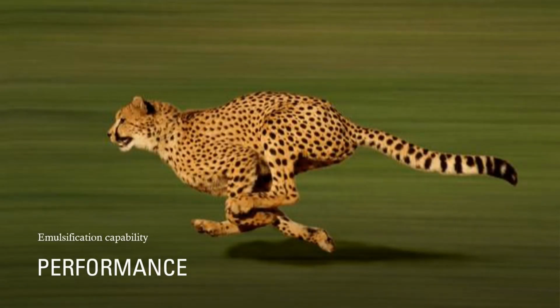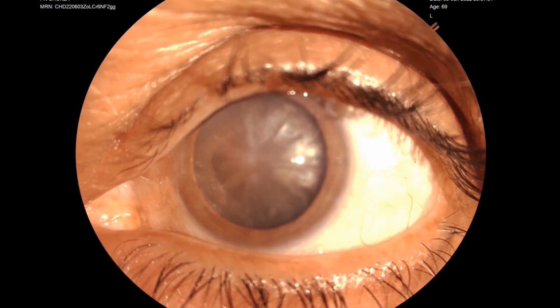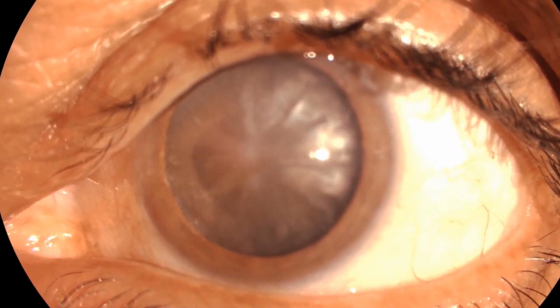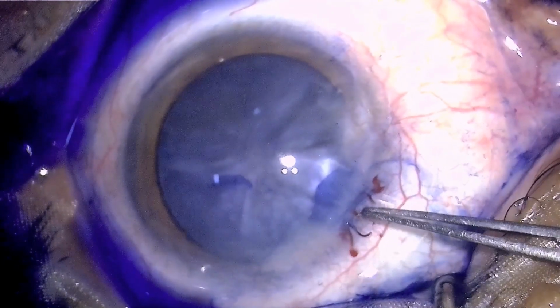Coming to the performance, I'll just demonstrate one case which was done for removing a hard cataract. This is the kind of cataract we are talking about. The machine which I was using was Appasamy Associates Galaxy Robot. This is the kind of cataract which one can plan for small incision cataract surgery rather than phaco, but I decided to do the phaco.